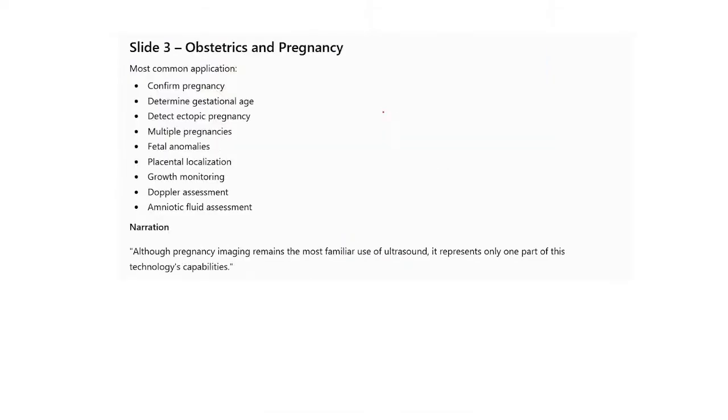So the obstetric and pregnancy application is the most common application of medical ultrasound: confirm pregnancy, determine gestational age, detect ectopic pregnancy, multiple pregnancies, fetal anomalies, placenta localization, growth monitoring, Doppler assessment, and amniotic fluid assessment. So narration: although pregnancy imaging remains the most familiar use of ultrasound, it represents only one part of this technology's capabilities. So let's delve more into that.